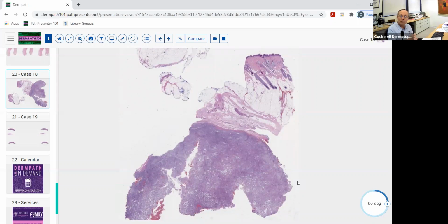subcutaneous nodule. A lot of times you think of something as subcutaneous, and it's really not. We see dermatofibromas that are a little on the deep side, maybe the lower dermis, whatever, and then get sent in as a subcutaneous nodule. Well, this really and truly is beneath the subcutaneous. It's not really even subcutaneous. This is in the fascia. So this was an incisional biopsy. You can't do a punch that goes this deeply. It just isn't going to get there.